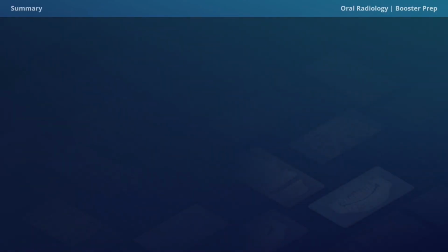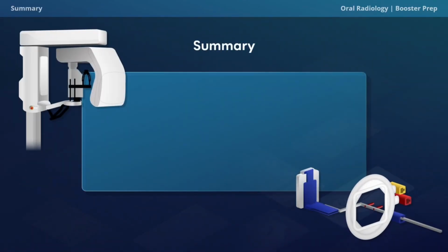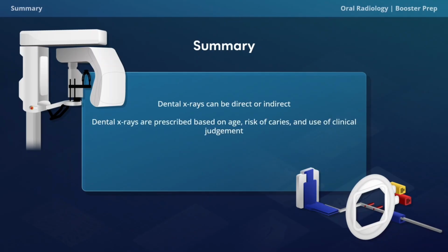All right, so as we come to an end, let's do a quick recap of what we went over in this video. So we went over how dental x-rays can be direct or indirect. We went over how dental x-rays are prescribed based on age, risk of caries, and the use of clinical judgment. And lastly, we learned how external objects and incorrect patient or x-ray positioning can lead to radiographic errors.